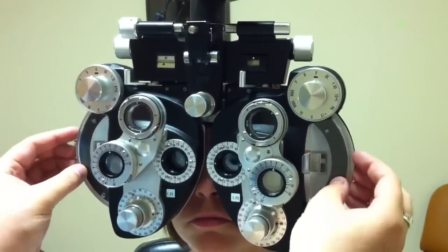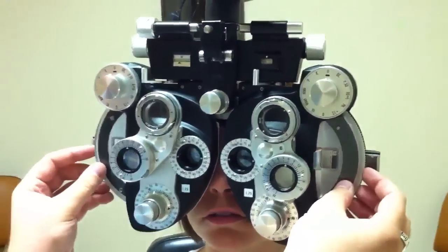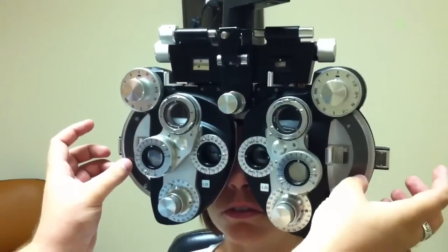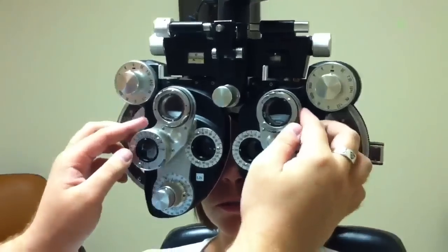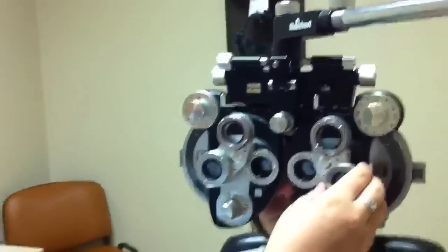So now I'm going to bring it down 50 on both sides. Does that look pretty clear? Yes. Do you like one more? Two — that one here? Yes, it's even better. Okay, and I would stick with that as my prescription.